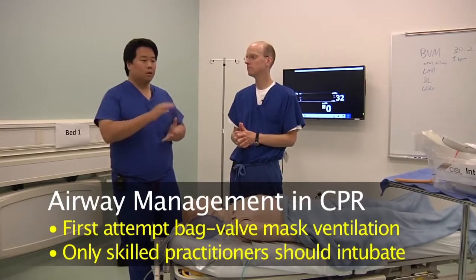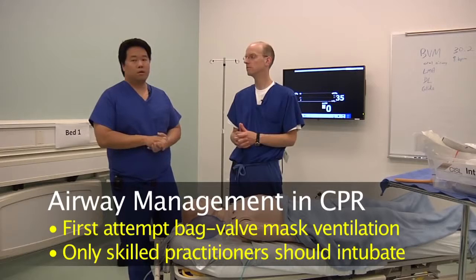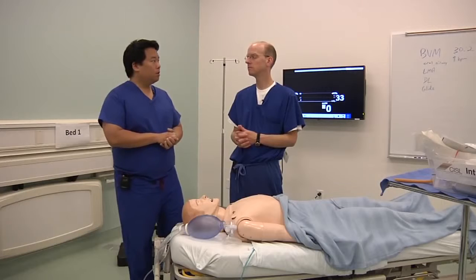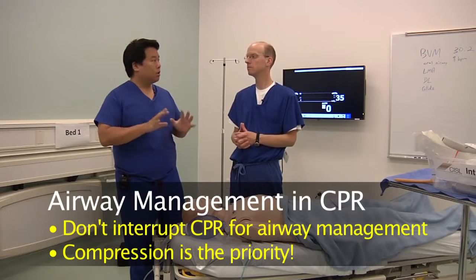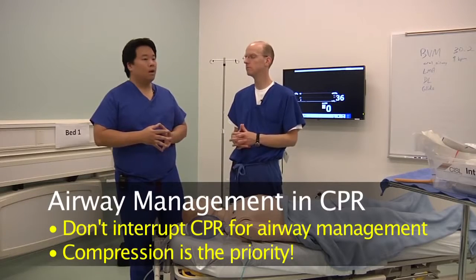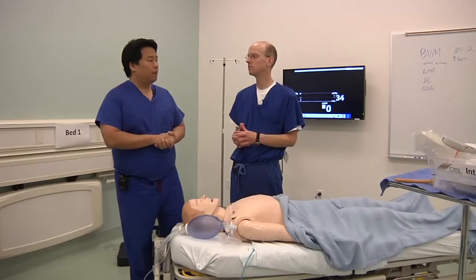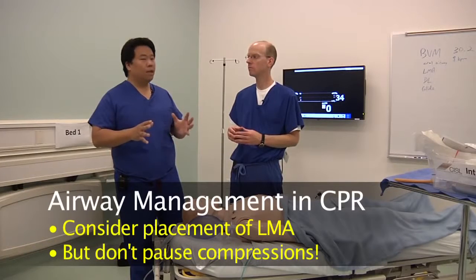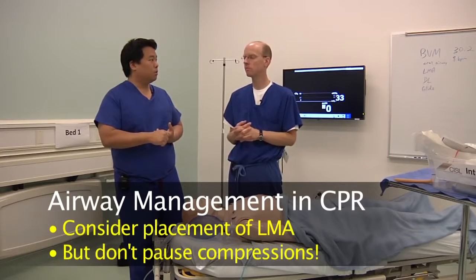Now, however, if you are somebody who does endotracheal intubation on a routine basis, if you're an anesthesiologist or another physician who's comfortable with performing endotracheal intubation, it may be reasonable to attempt endotracheal intubation between compressions, but certainly don't hold chest compressions. Now, if even that expert cannot achieve endotracheal intubation, it may be reasonable after a period of mask ventilation to attempt laryngeal mask airway placement. But again, to recap, certainly don't pause chest compressions, don't pause CPR in order to secure the airway.